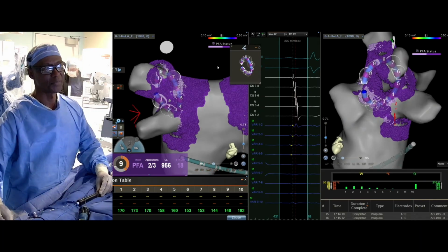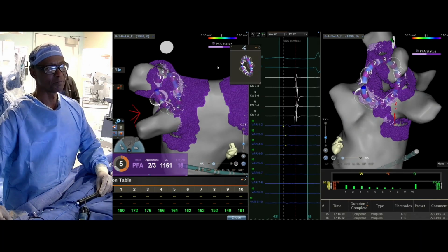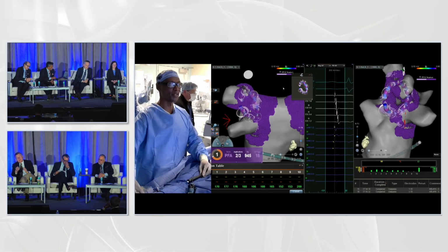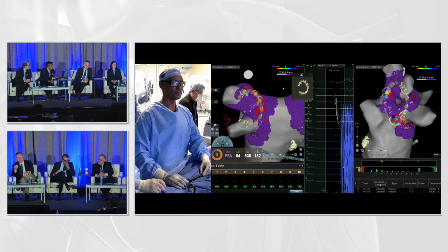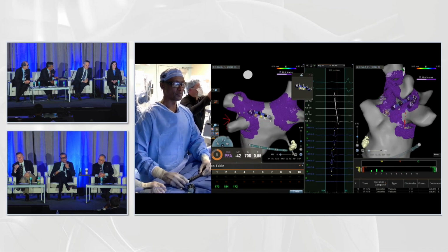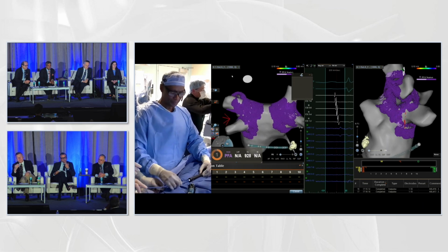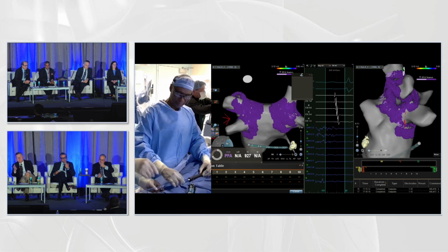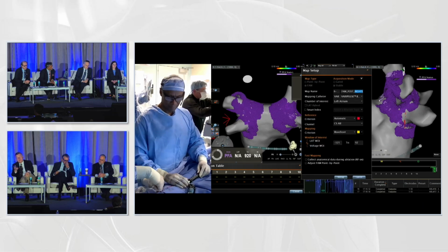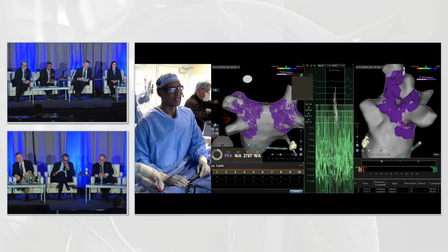John, have you played with this catheter? I have not used this catheter. I was going to ask, in terms of the indicator of approximation to the tissue, what is the tactile feedback like on this catheter? Is there consistency between whether you feel you're in contact and what the indicator shows you? Is it somewhat disparate?